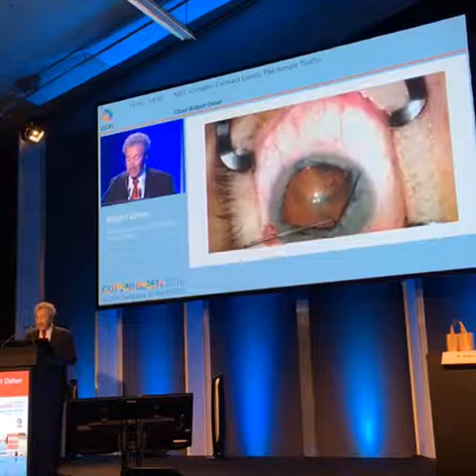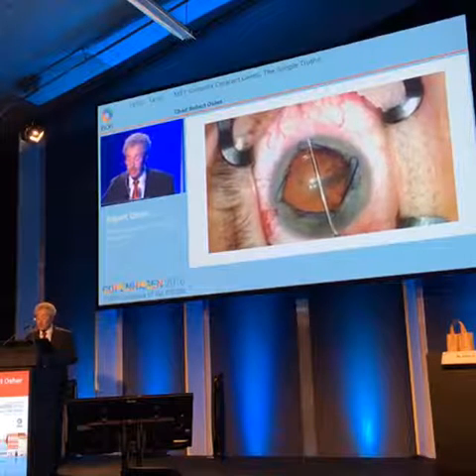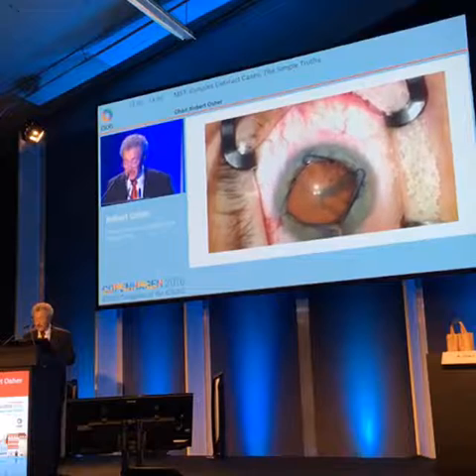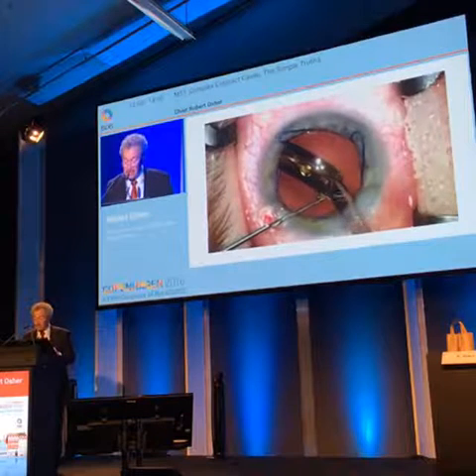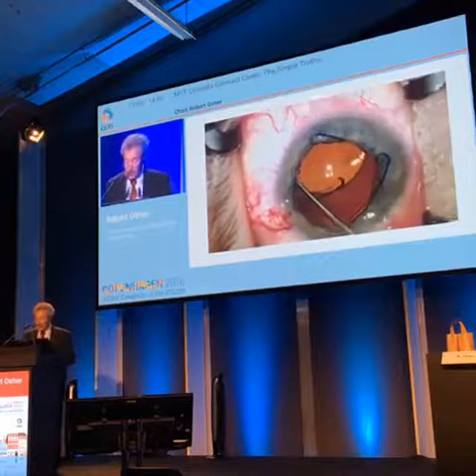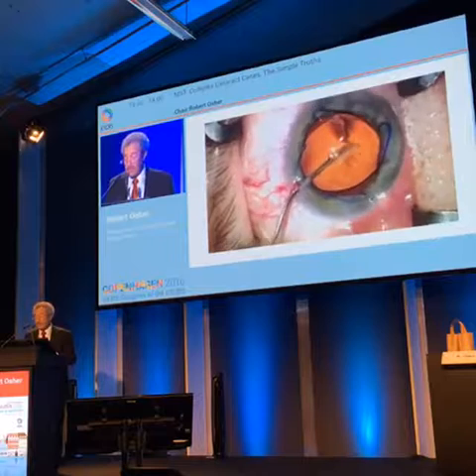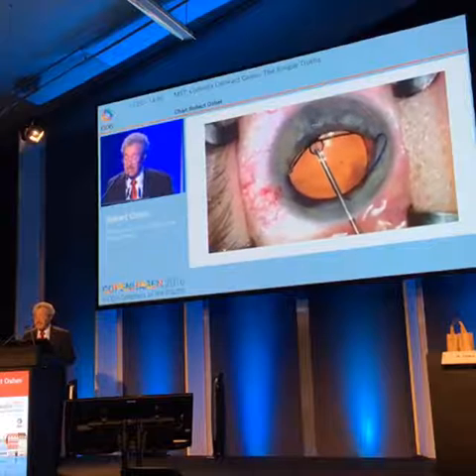There's a lot of different methods, and I'm sure Dr. Malugin and Dr. Maskett will show you their own preference. This is a manipulating instrument, which I find very easy, and you saw the new injector. I center the ring, and then after the lens is injected, it's time to take the ring out. Now notice the sequence. There's two choices. In this case, I take out the OVD first. From behind the lens, I put in more OVD, and then I disengage the distal ring.